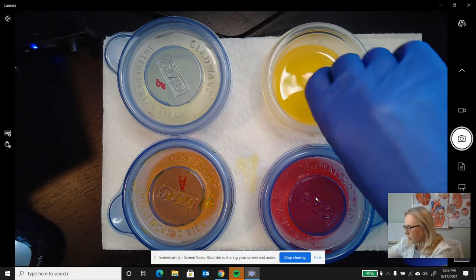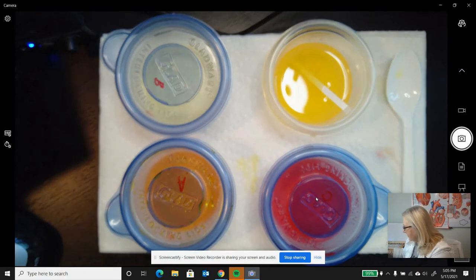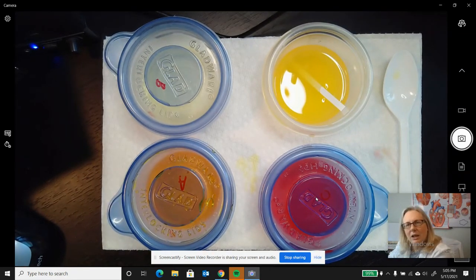All right, let's put the glucose strip in. Oh, I dropped it. I'll get it in a moment. See how cloudy that is? You can see how cloudy it is with that strip in there. You can barely see the strip at the bottom. So that just gives you another idea of what the clarity is, okay? Definitely a cloudy, floaty type of situation, right?